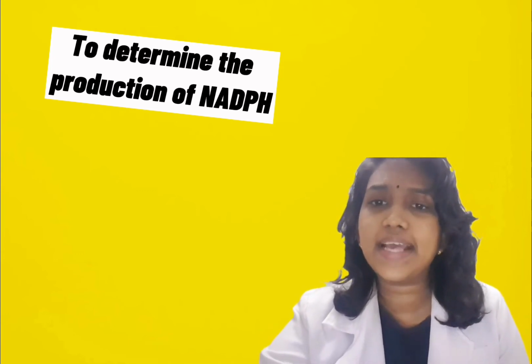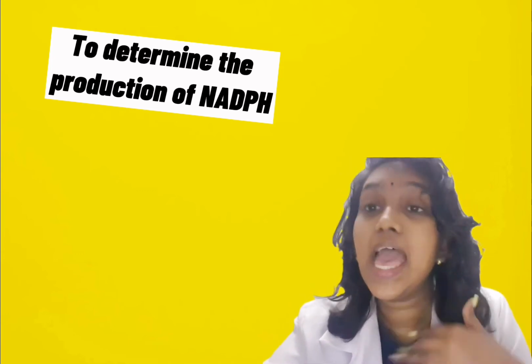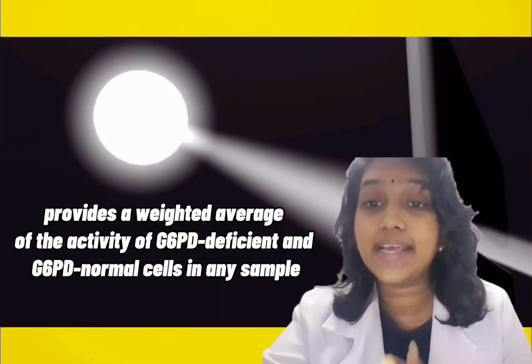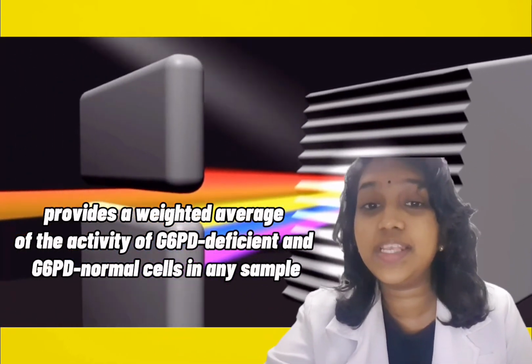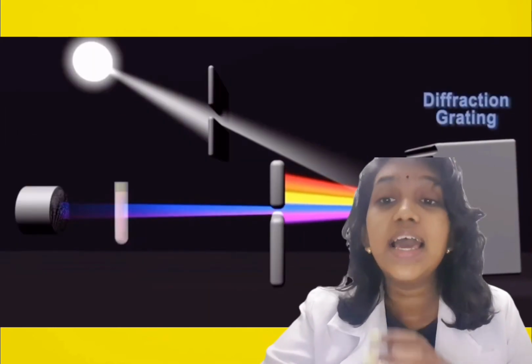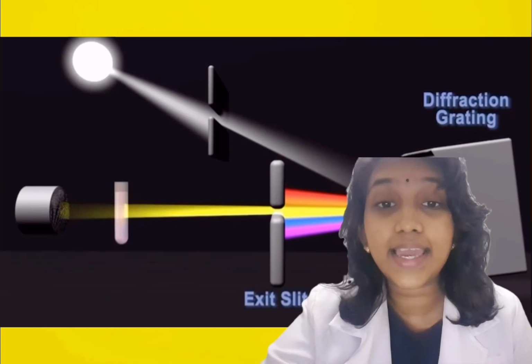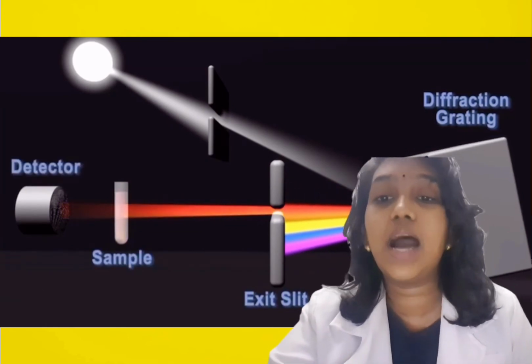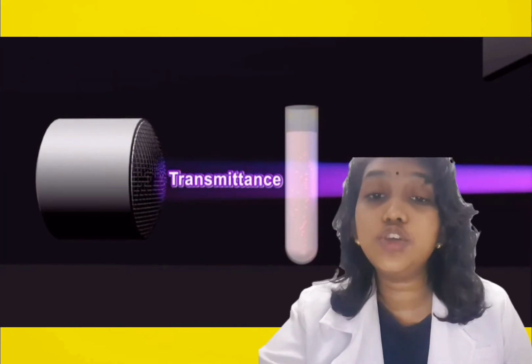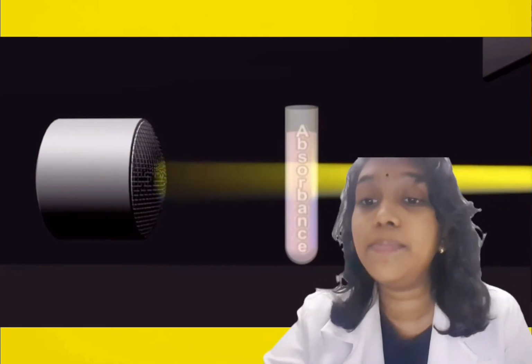The gold standard for assessing G6PD enzyme activity in red blood cells is the spectrophotometric test, which provides a weighted average of the activity of G6PD deficient and G6PD normal cells in any sample. As a result, it is utilized as a benchmark against which future point-of-care tests are measured, both quantitatively and qualitatively. We have to note that the concentration of hemoglobin in the blood sample might influence the G6PD reading in anemic or iron deficient patients.